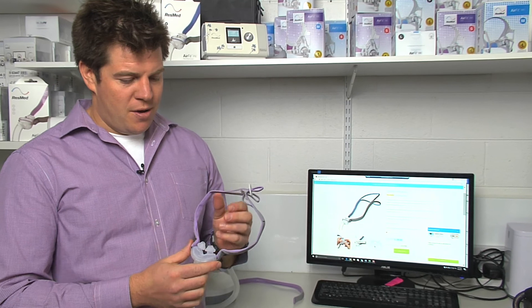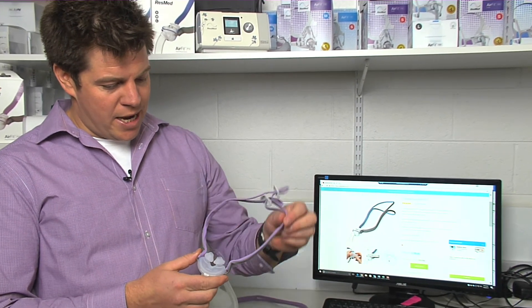So there you have it. Putting the P10 back together is nice and simple. Freshening up your mask with a new headgear strap and a new pillow will make a big difference in your therapy.